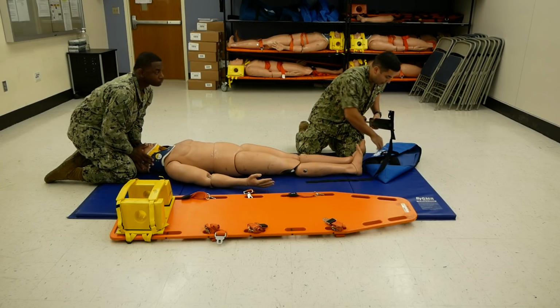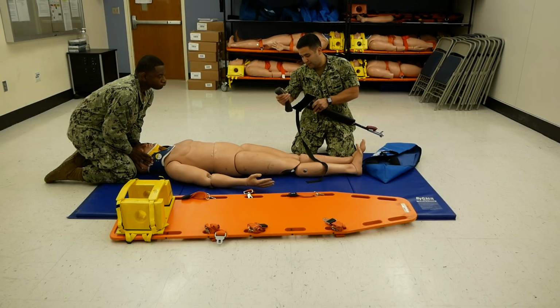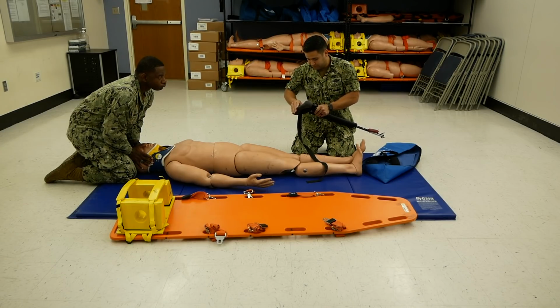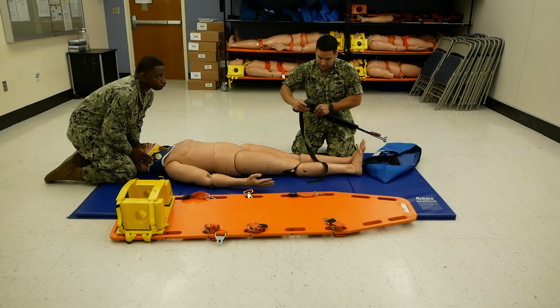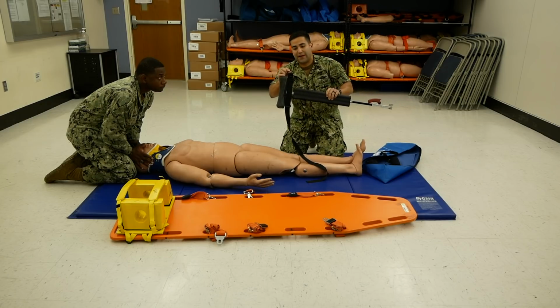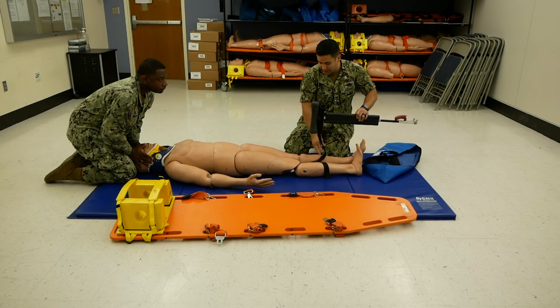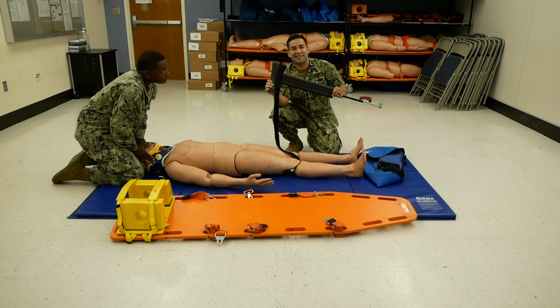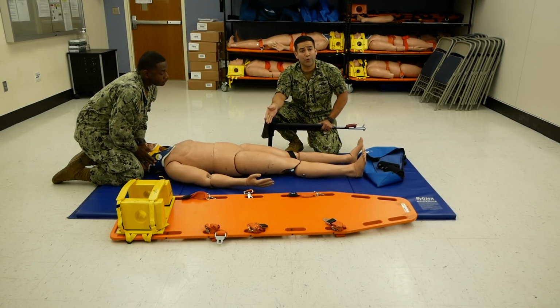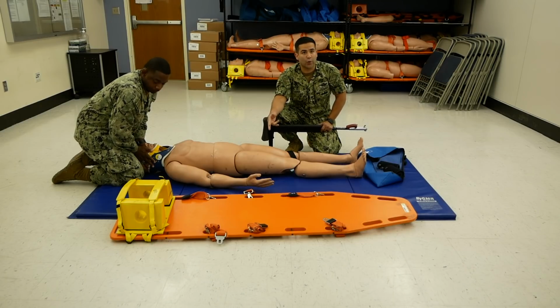There is a guard you place on the top of the Sager for patient comfort. Make sure that the D-rings are facing up, so it is easily secured to the patient. Now that the traction splint is put together, you want to go ahead and remove the patient's clothing from that affected limb. So go ahead and cut away the clothing.